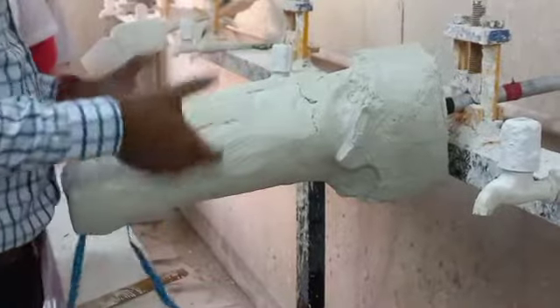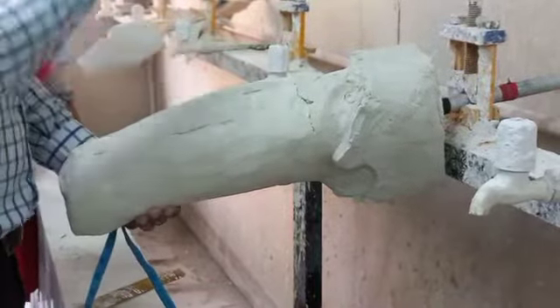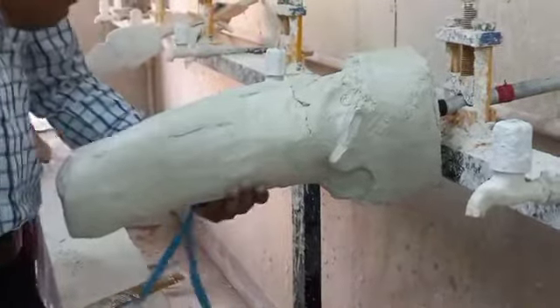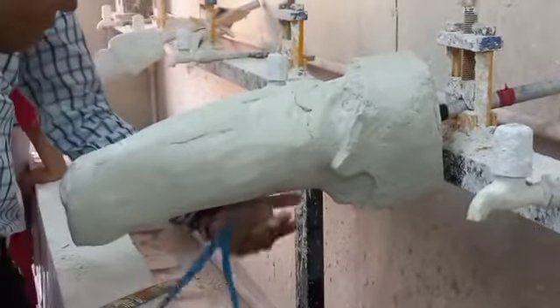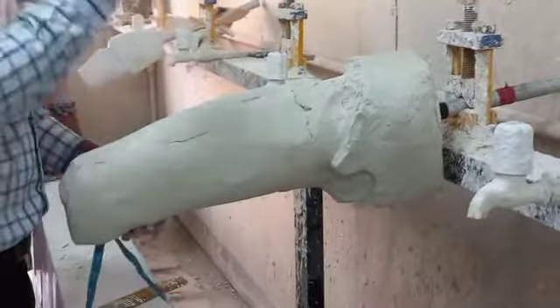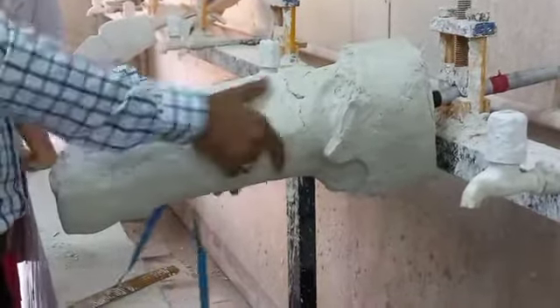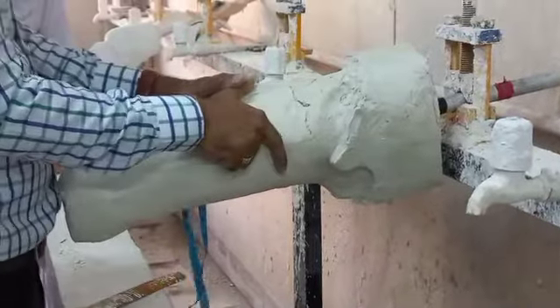Keeping in mind that your compression has already come with the casting. During casting that compression has come because of the soft tissue which is pressable, which has already been pressed because of the compression of the bandage. Keeping that in mind, we should not be disturbing the shape of the positive mold.